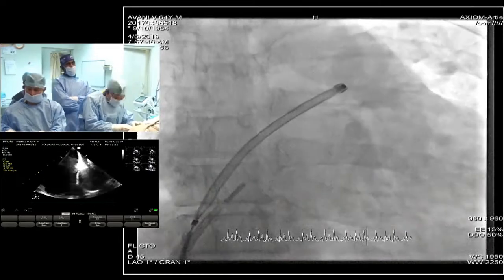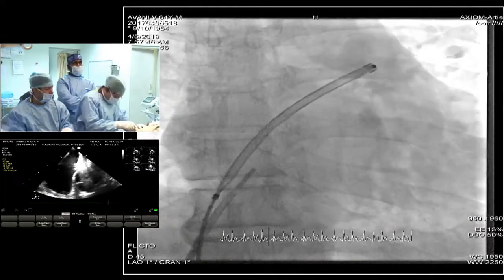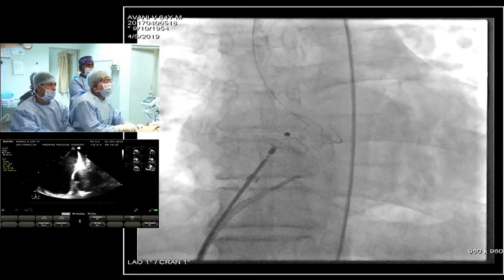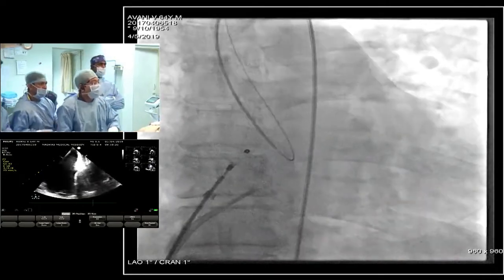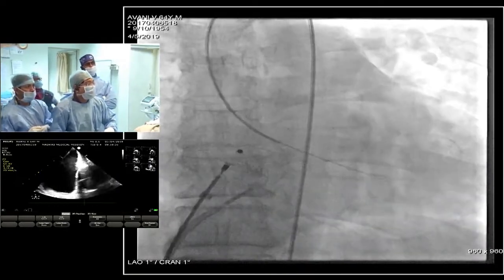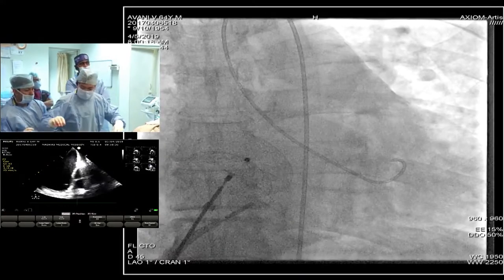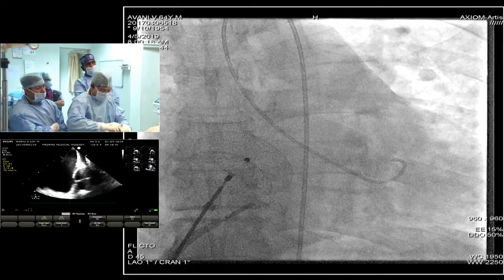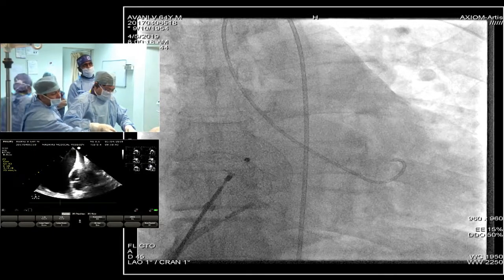However, I would also like to say that if I have an extremely older patient in whom I anticipate a substantial elevation of left ventricular end diastolic pressure and a restrictive LV physiology, in those patients I do balloon testing in order to find out the amount of elevation of the left ventricular end diastolic pressure and the amount of elevation of the left atrial pressure. Sometimes we take two parallel wires, one balloon goes through and closes the defect, and the second catheter is in the left atrium to directly measure the LA pressure.